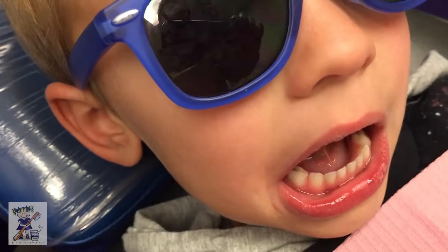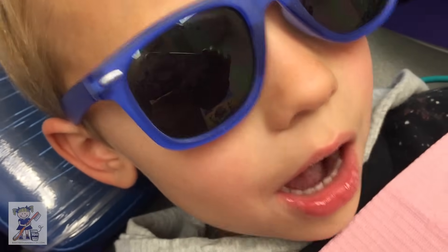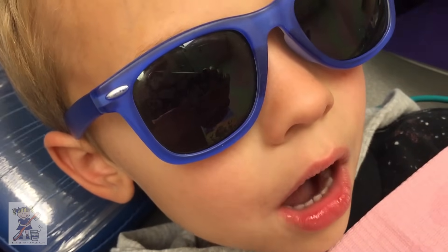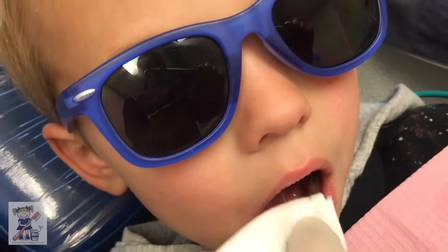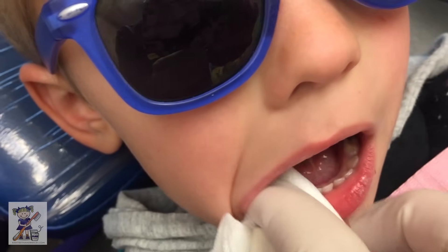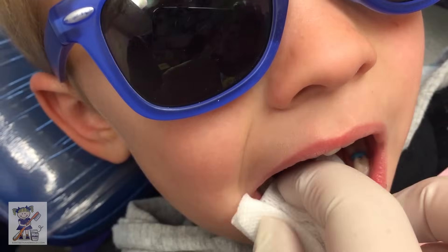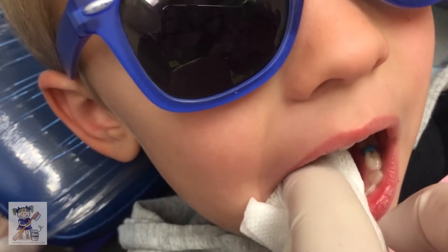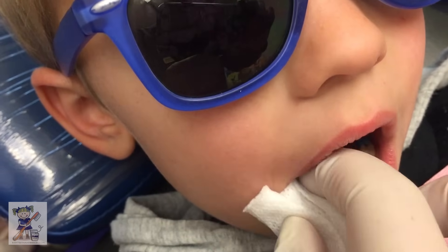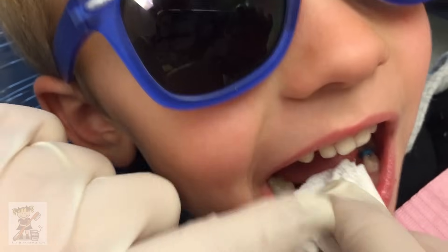So we dry out the crown. We're going to mix the Fuji Cem 2 and we're going to seat it on there. You're being so good. I told my friend to make sure he doesn't eat sticky candies like caramels and Starburst because it might take his little Spider-Man crown off. Right? You're being so good.